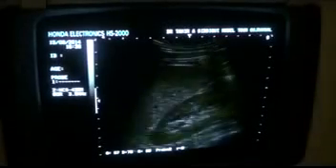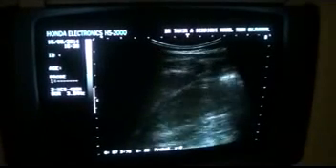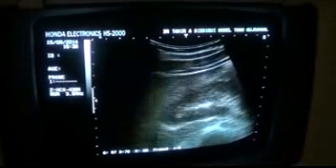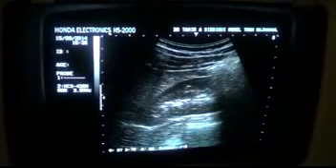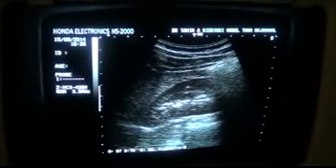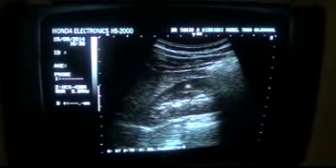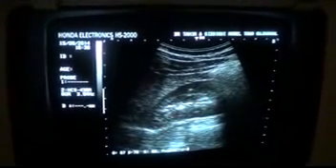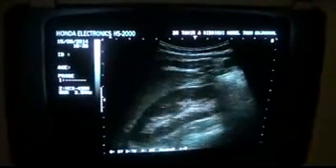Here I have magnified a bit so it will become easy for you to evaluate. Patient is in left lateral decubitus posture. I have asked him to take a deep breath and hold the breath solidly. Now you see this is a tiny cystic area, tiny tubular area. This is the arcuate vessel, which should not be confused with a calculus or concretion.